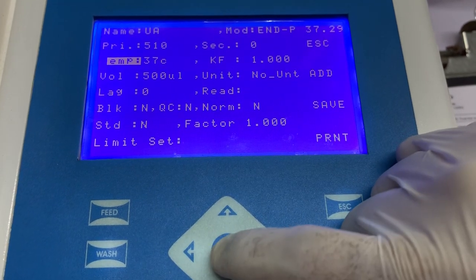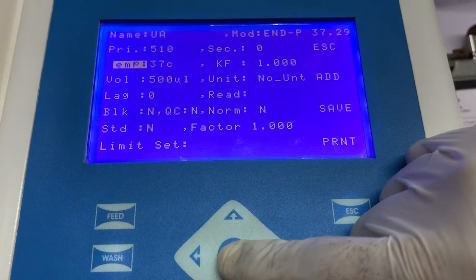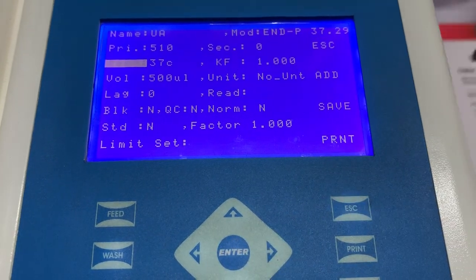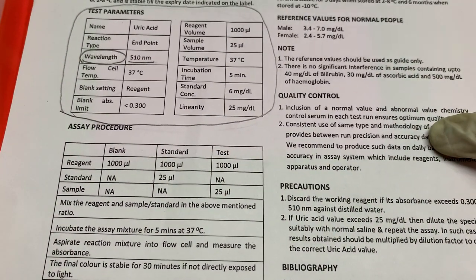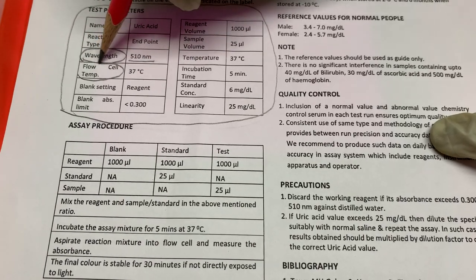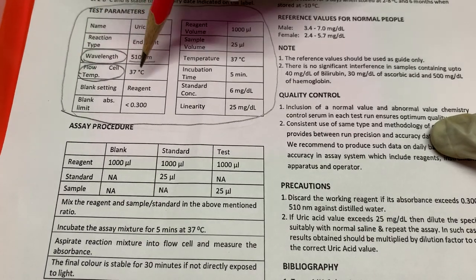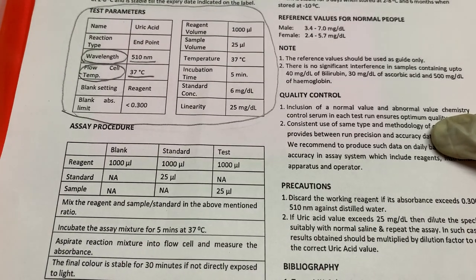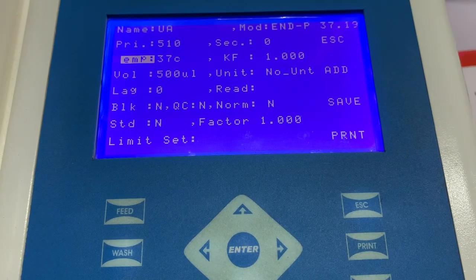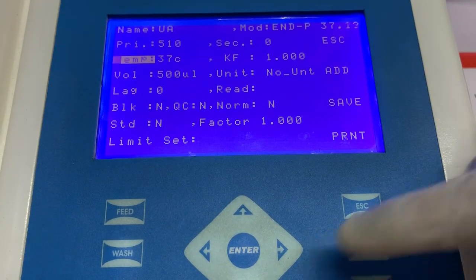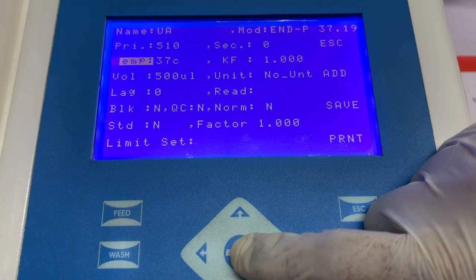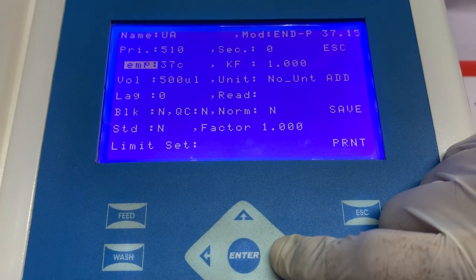Next, we have to enter the information of temperature, or the flow cell temperature. Again, this information can be seen in the instructions for use, where the manufacturer clearly mentions at what temperature the absorbance needs to be taken. In this case, the default temperature mentioned is 37 degrees Celsius, so we do not have to change it.